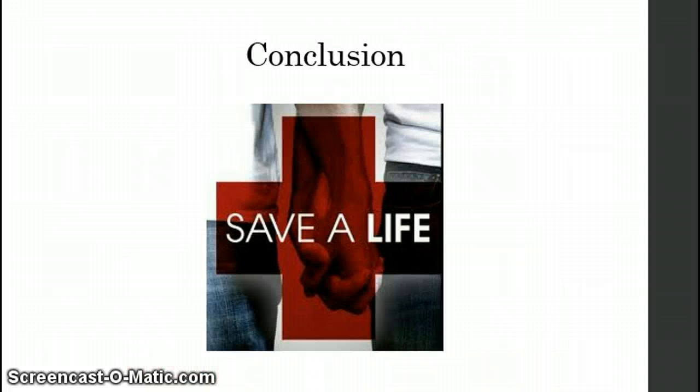It's so important to be able to recognize and differentiate cardiac rhythms. On telemetry floors, the CMUs, also known as central monitoring units, help nurses watch their cardiac monitors. So for those who are on continuous telemonitors, they're always being watched. It is up to the medical team to interpret a problematic rhythm quickly and correctly. The interpretation of the rhythm determines the treatment.